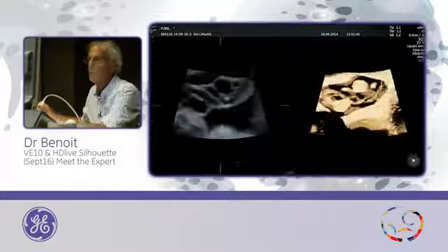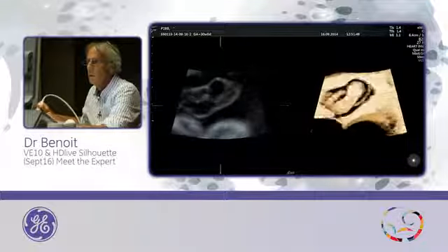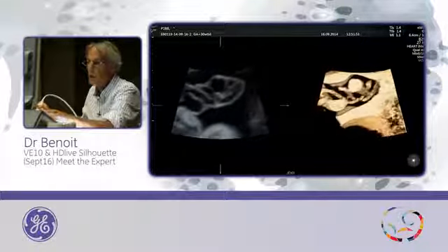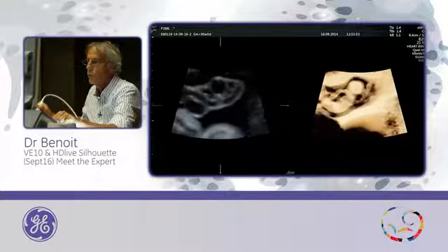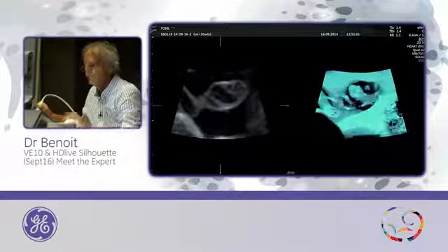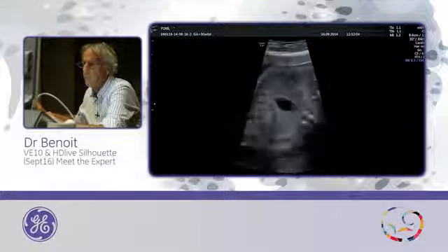Okay, I start. And this is a view of the cord with one vein and two arteries, and we can change transparency. I increase the thickness, and I can switch to the blue. Okay, I will do it here.